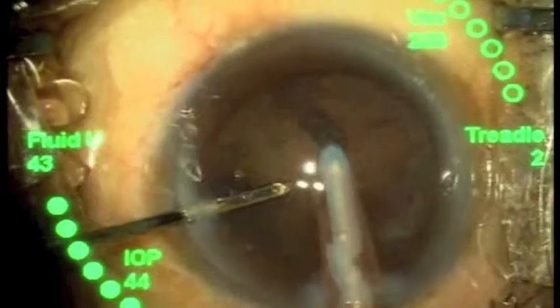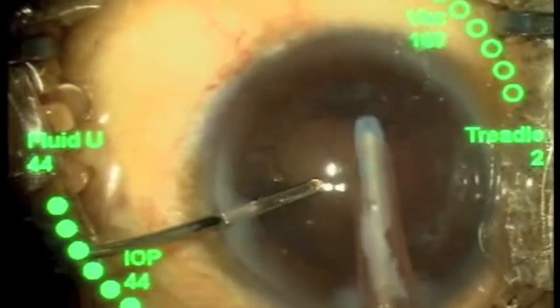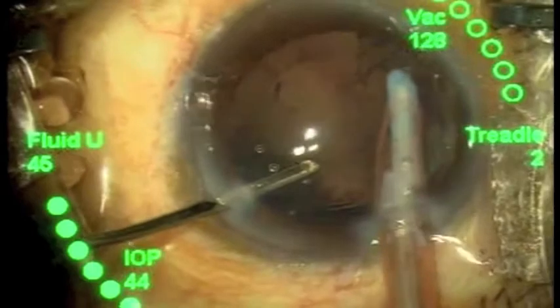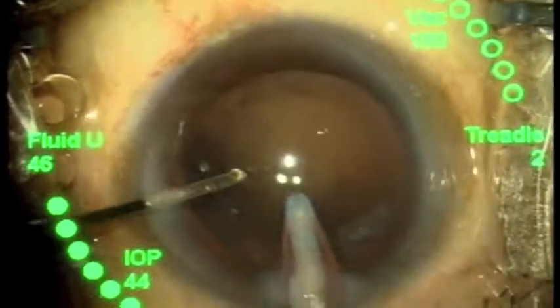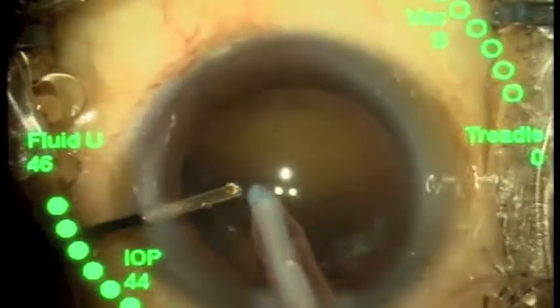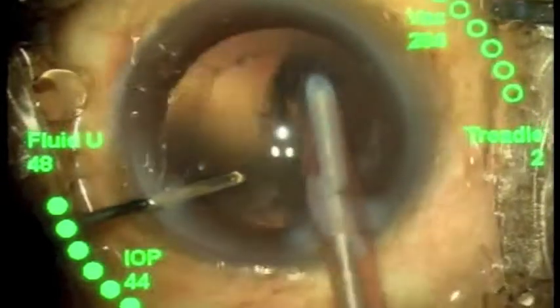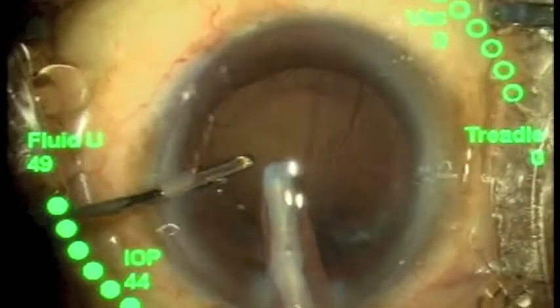This is a straight handpiece with a silicone tip during irrigation and aspiration. The second hand through the side port will have a 25 gauge mini aspirator, which allows aspiration of the sub-incisional cortex much more easily.